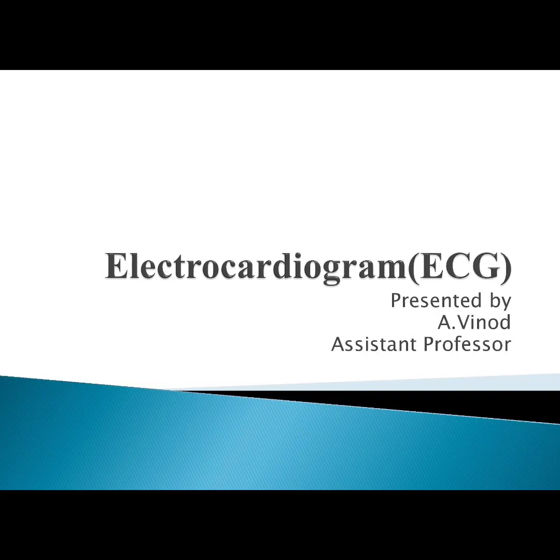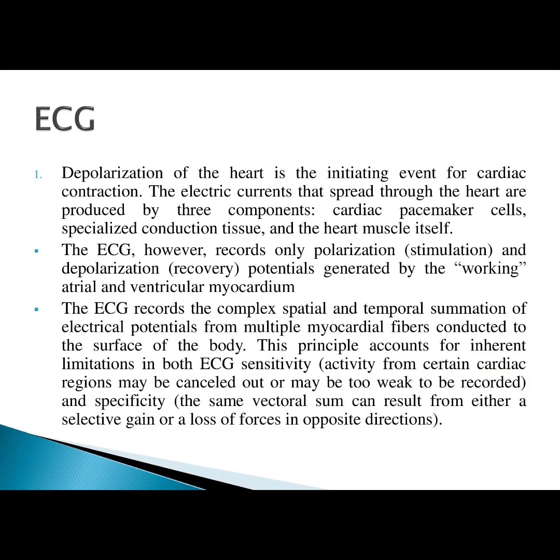In this video, we are going to discuss a case study regarding implementation of a smart fabric system for monitoring ECG, that is electrocardiogram, and respiration. So, what is meant by electrocardiogram?